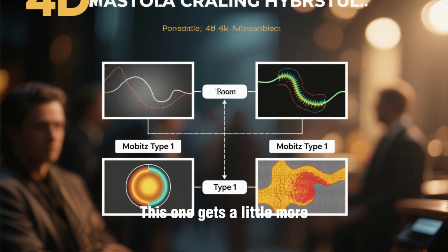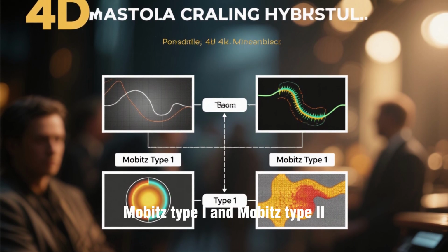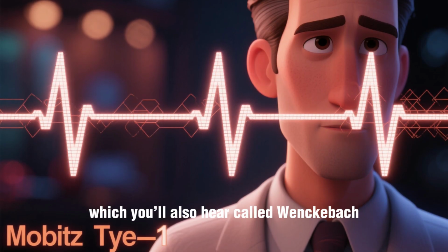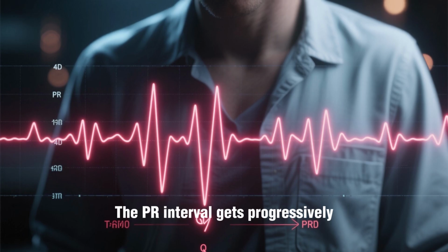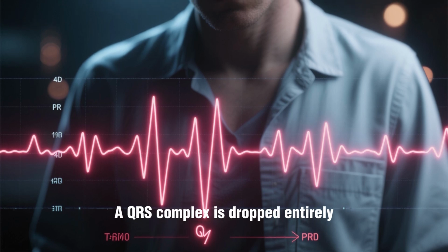Now for second-degree AV block. This one gets a little more interesting, because it comes in 2 distinct flavors you absolutely need to tell apart: Mobitz Type 1 and Mobitz Type 2. Let's start with Mobitz Type 1, which you'll also hear called Wenckebach. This rhythm has a very specific, repeating pattern. The PR interval gets progressively longer with each beat, until a QRS complex is dropped entirely.